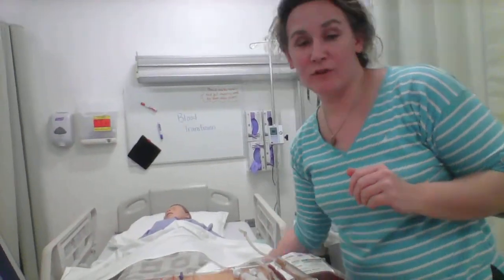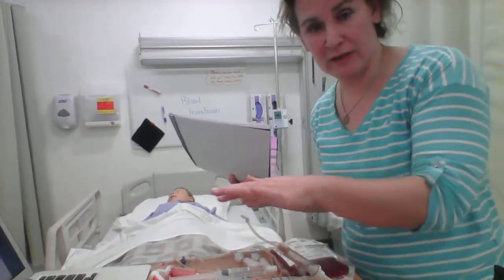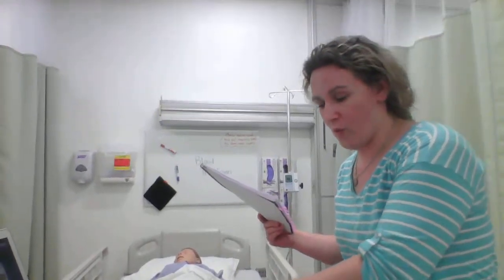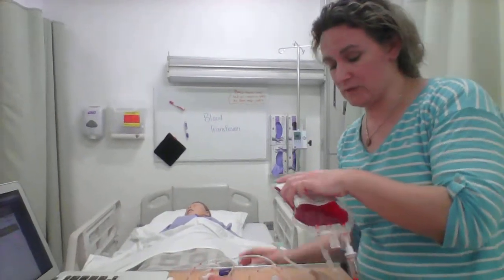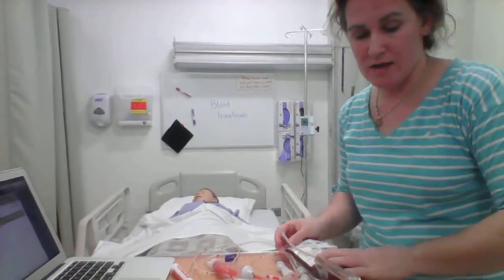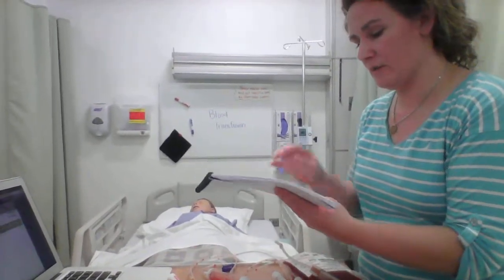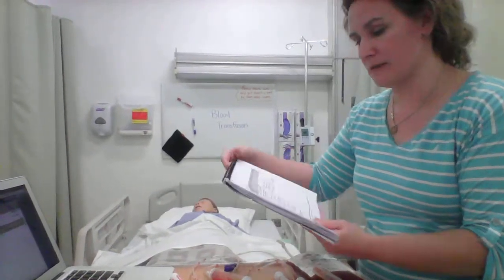Okay, we're back for the blood product, and we went ahead and performed hand hygiene before we collected all of our supplies. We got a bag of normal saline, we got flushes, we got Y tubing, and we got the red blood cells, and this was B positive for Robert Crowley, and it's not expired, and the packaging is intact. And then we also got a graduated container for the urine, and alcohol swabs. And now that we've picked up the blood, we have to use it within the next 30 minutes.